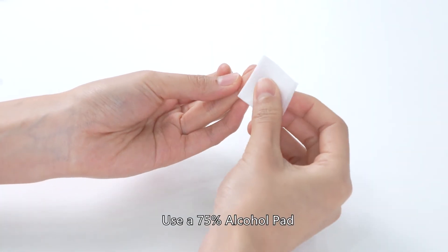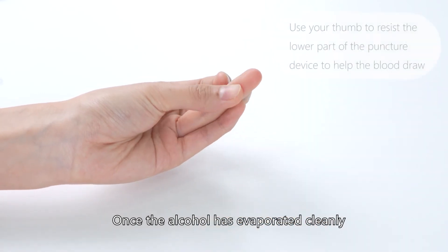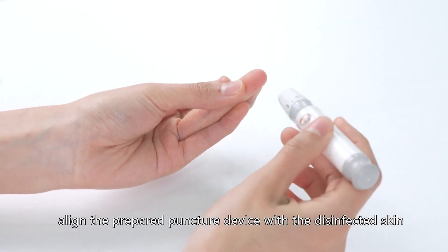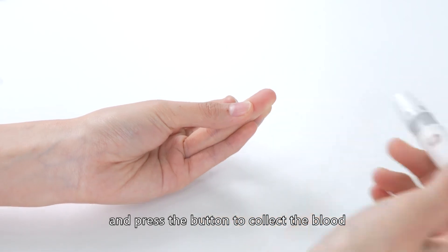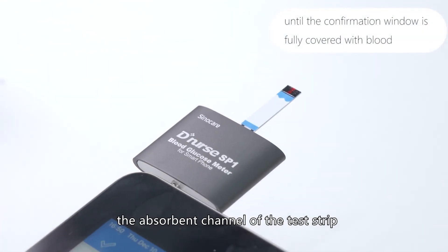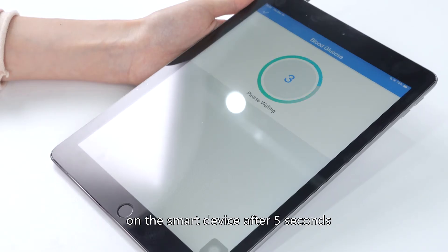Use a 75% alcohol pad at the blood sample site for disinfection. Once the alcohol has evaporated cleanly, align the prepared lancing device with the disinfected skin and press the button to collect the blood. Apply the blood sample to the opening of the absorbance channel of the test strip. The meter will display your blood glucose value on the smart device after 5 seconds.